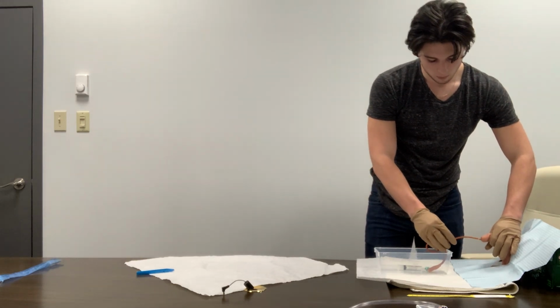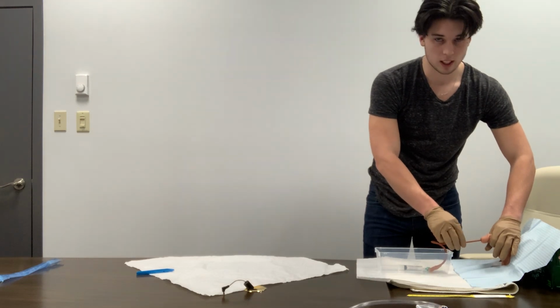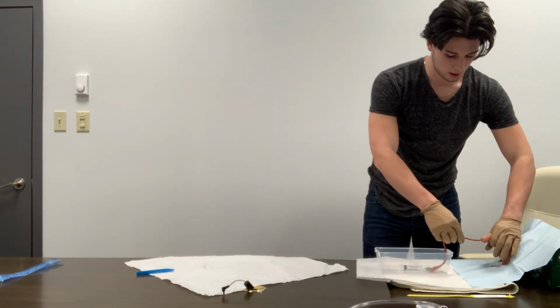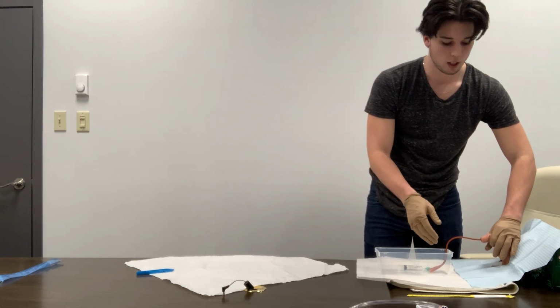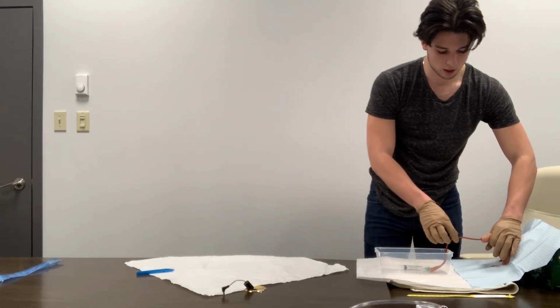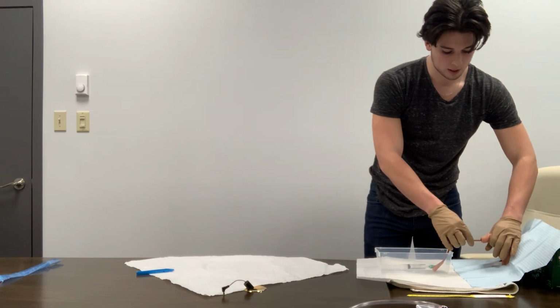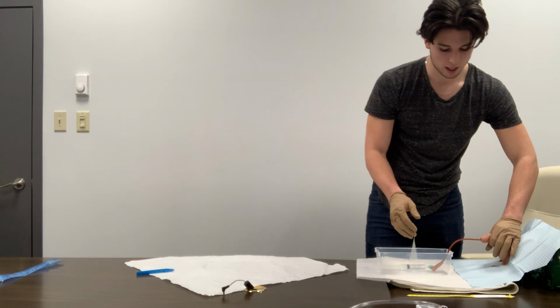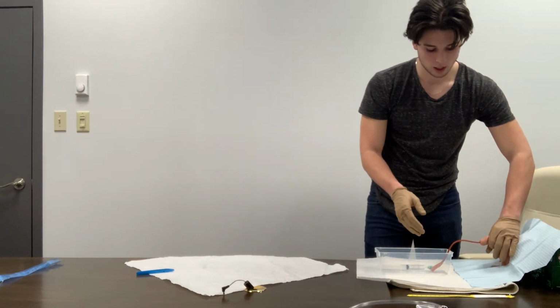So we are going to go in the penis. We're going to go up about 6 to 8 inches. So we're going to say that that's about 6 to 8 inches, and we see urine coming out now. So that means we are just touching the bladder. So we'll go about 1 inch or 2 inches more inside so that we can assure that we are in the bladder.